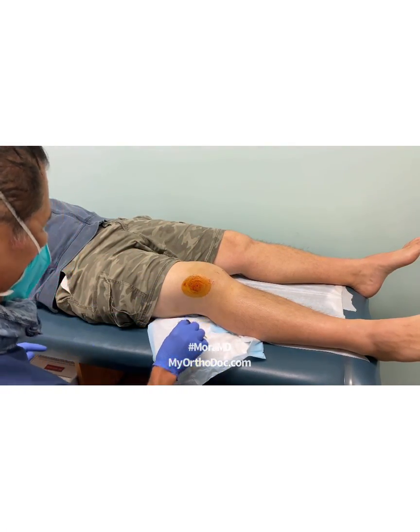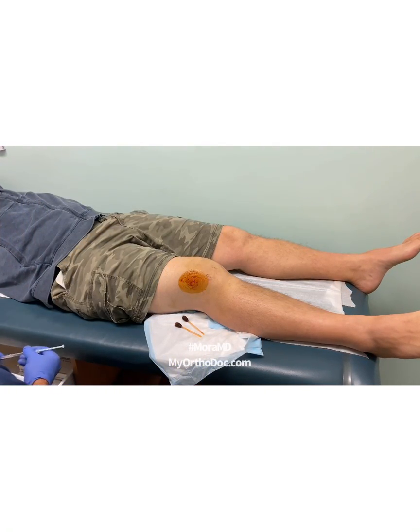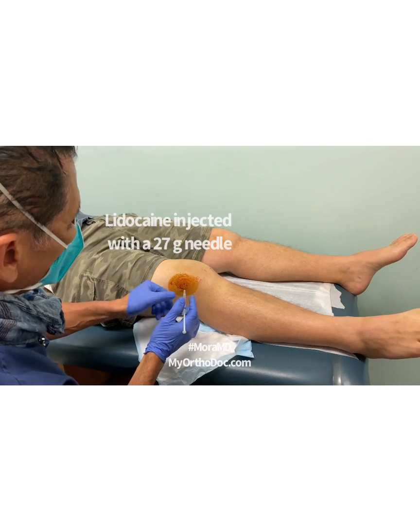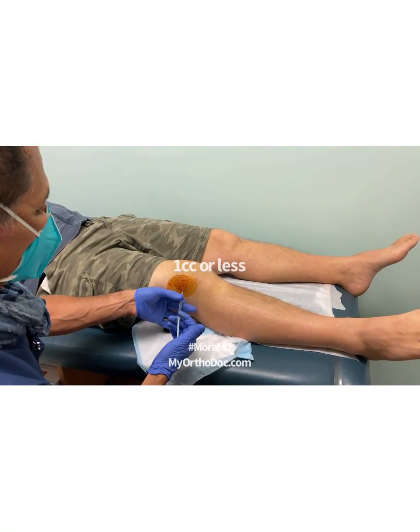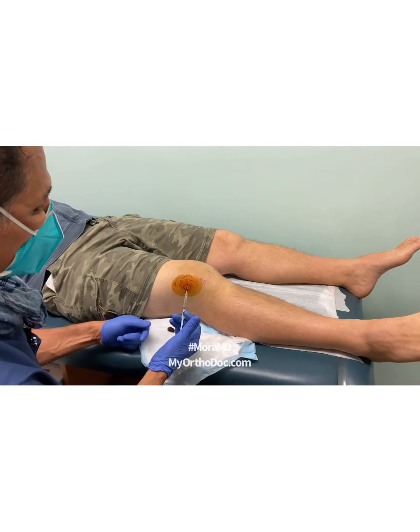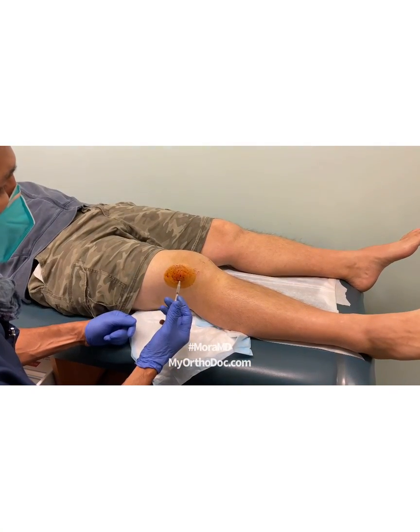I've already marked my spot — that's going to be my entry point. I'm going to use a tiny little 27-gauge needle, which is very fine and usually doesn't cause problems. I'll inject the skin and the tissue just under the skin. Are you doing okay so far? Good, awesome.